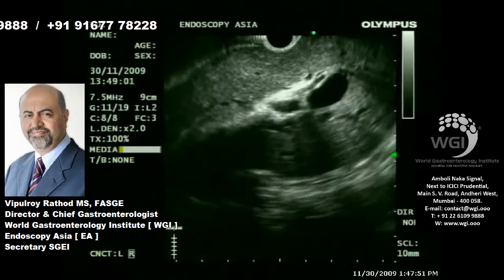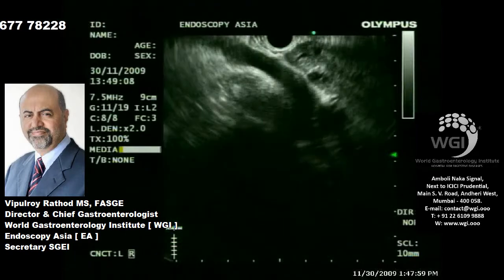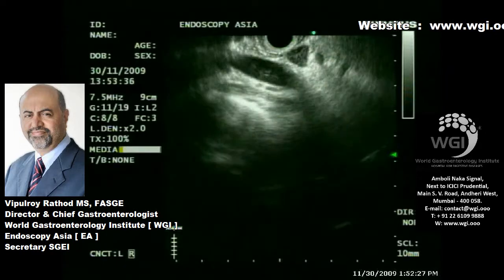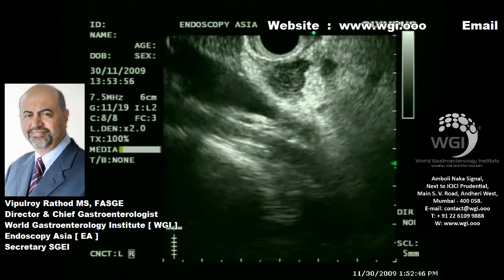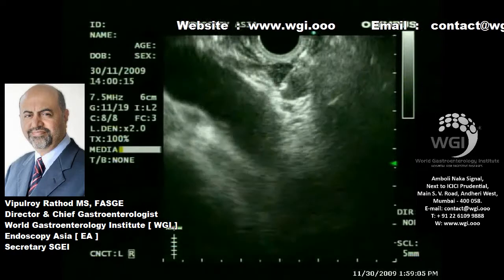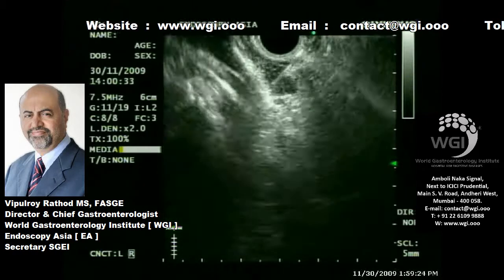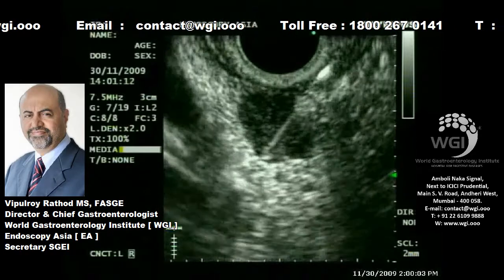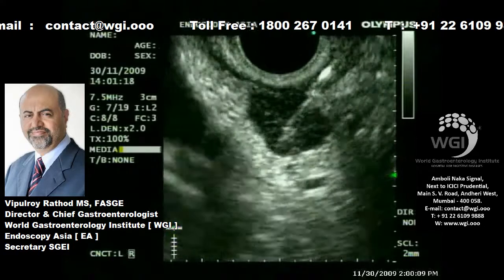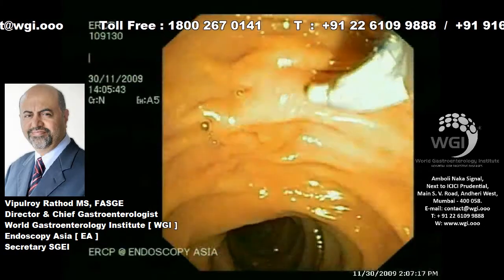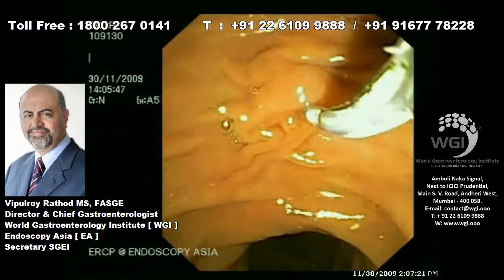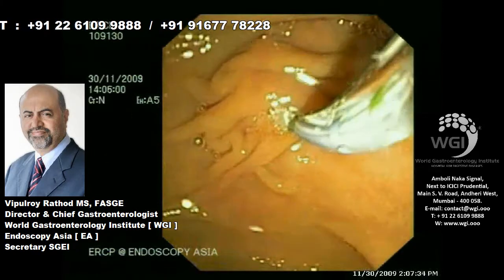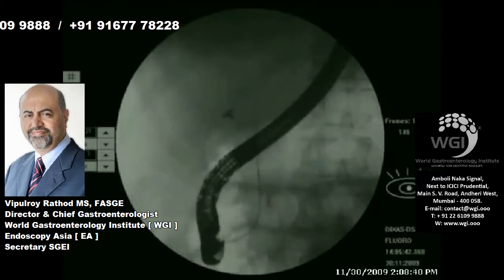You can see massively dilated intrahepatic bile radicles in the left lobe of the liver. This is transgastric evaluation, which allows us to assess the stricture from the stomach as well. This is EUS-guided transgastric FNA of the hilar lesion. This patient also has multiple comorbidities such as poor cardiac function and underlying diabetes.